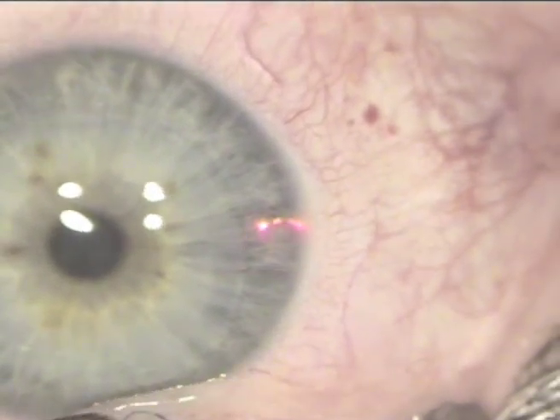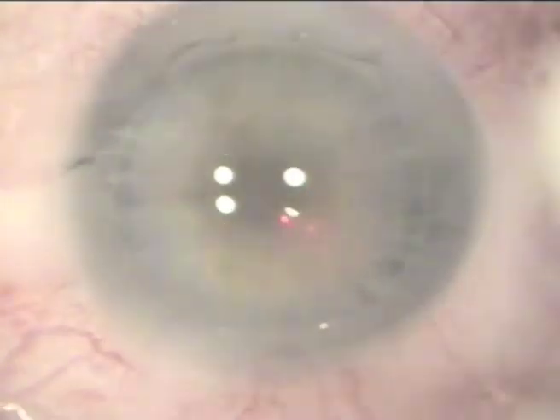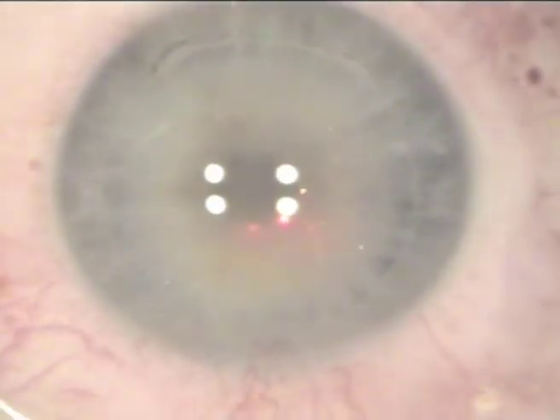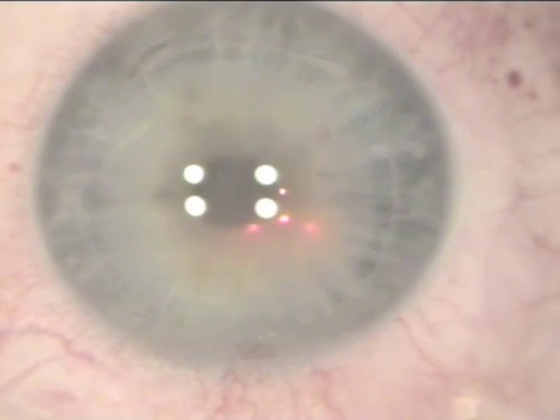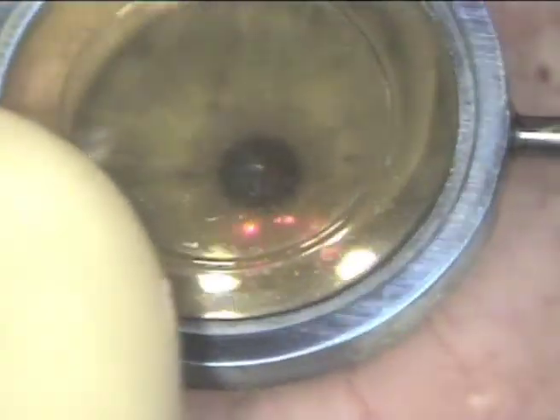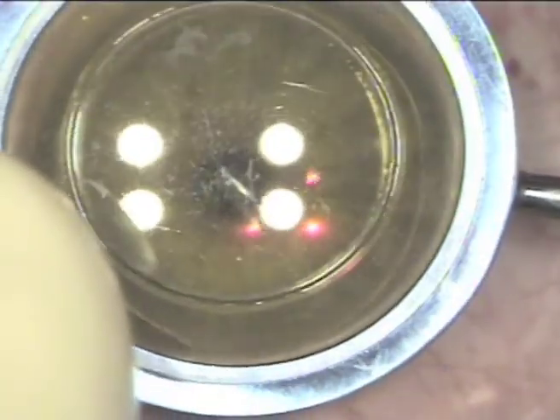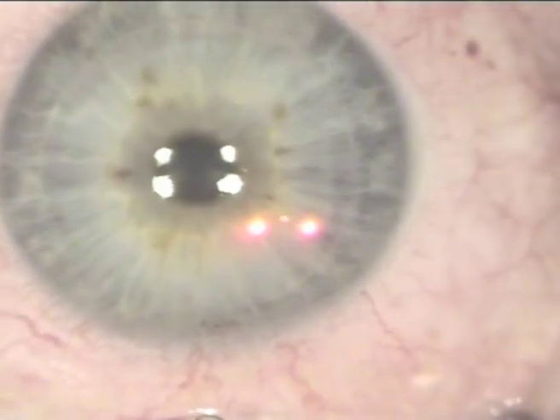Again, copious irrigation here. As I noted previously, we use aspirating speculi, so all the irrigating material is being removed from the ocular surface. No other manipulation of the flap. We will put a drop of Pred Forte, which is of milky consistency. It's a suspension, and it will delineate the edges of the flap to assure correct position. Here, a Johnston applanator is used to iron out the central striae, which are commonly seen in a myopic LASIK, out to the periphery of the flap.